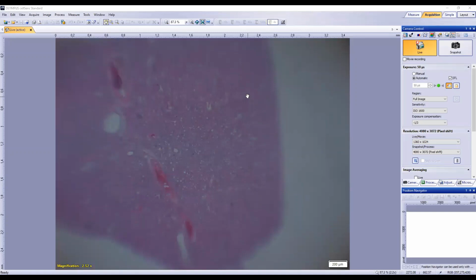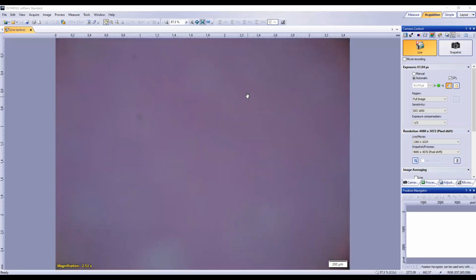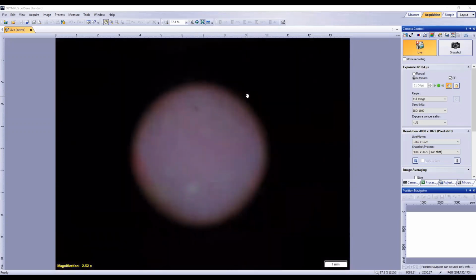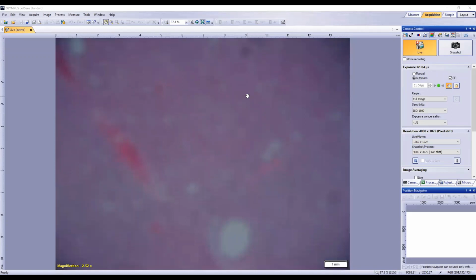Shubo and Emily, how about we pop up the slide onto the stage, and we'll hang around at 5x for a bit. And I really like that low power trick, putting the slide on the light source and then adjusting the stage to suit. You won't have time to do that sort of thing in the boards exam, but if you've got large chunks of tissue like brain, liver, lung, kidney, sometimes it's handy too. That can be a really good way of getting your overview picture, if you're not using digital, of course.